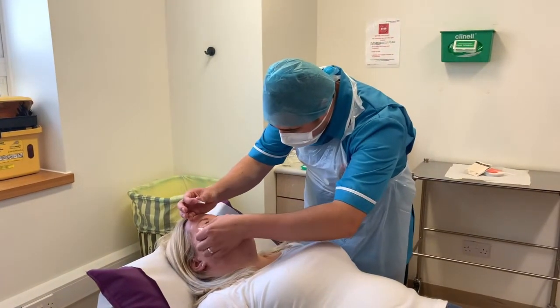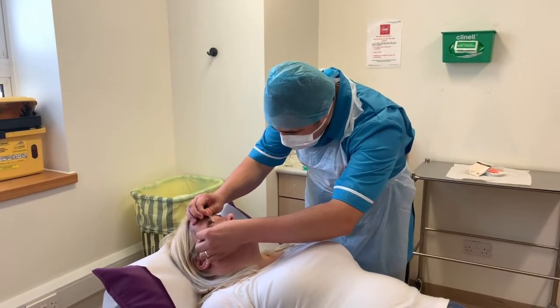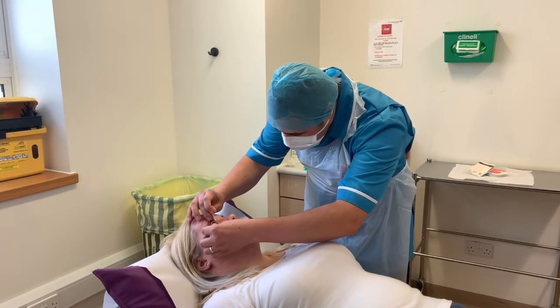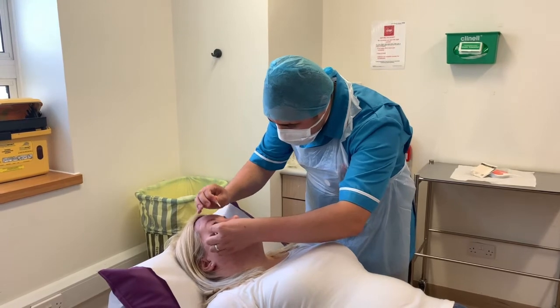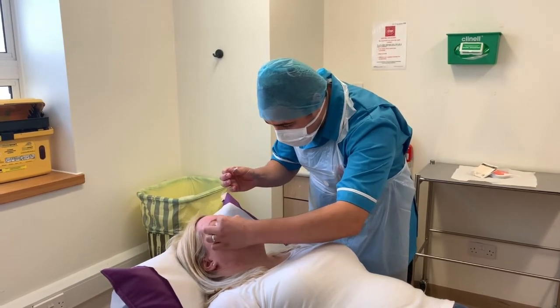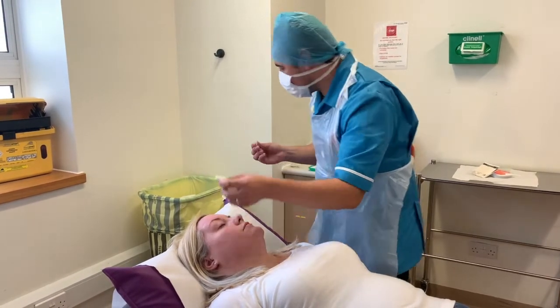So again, if you can have a look up here. And look down, please. And up again. Fantastic. Close the eyes gently. Good.